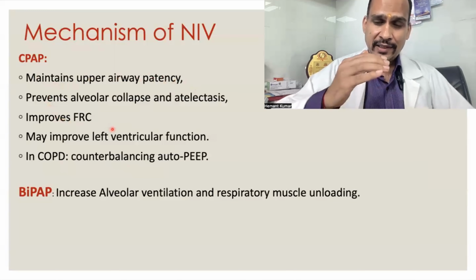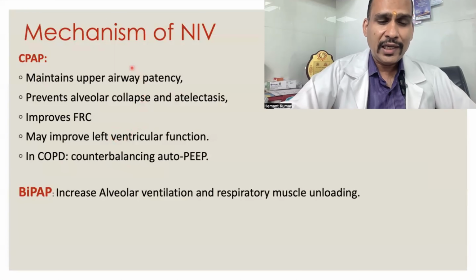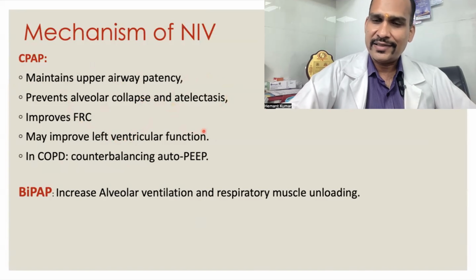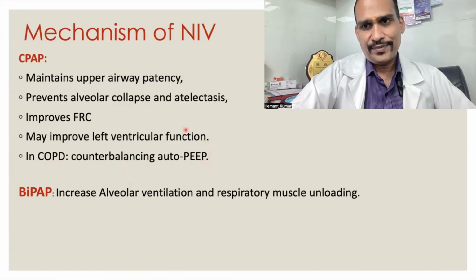And it gives PEEP or CPAP, so it will not allow alveoli to collapse. It prevents basal atelectasis, so it will improve functional residual capacity. It may improve left ventricular function, and if the patient has COPD, it can reduce auto-PEEP. So this is the function of CPAP.